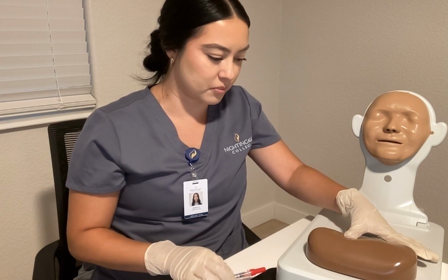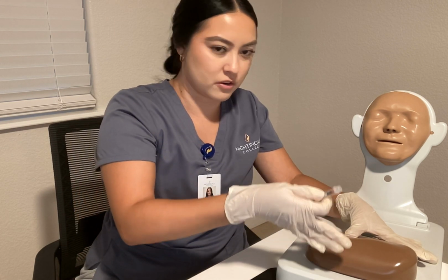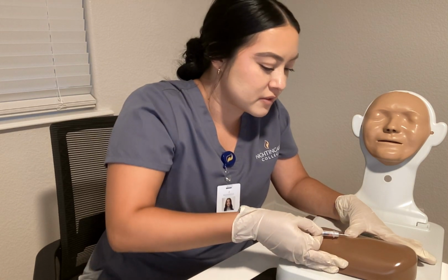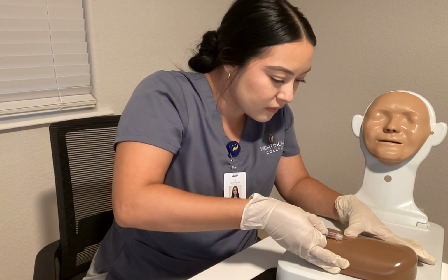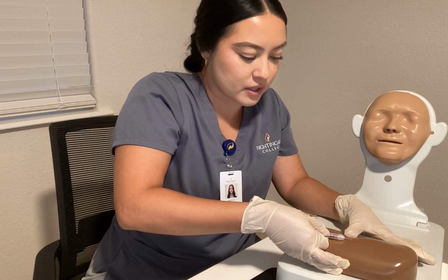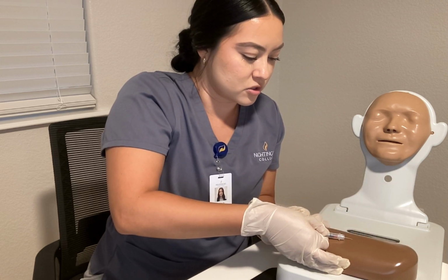So I'll just pull the skin, take the needle out, and make sure that the bevel is up. And then you're going to do three fingers down here, and we're going to go at a 5 to 15 degree angle into the skin. All right, Mr. Smith, in 1, 2, 3. Perfect. Once it's in, you want to completely steady your hand. I'm going to now let go with my non-dominant hand, and I'm going to inject the medication.